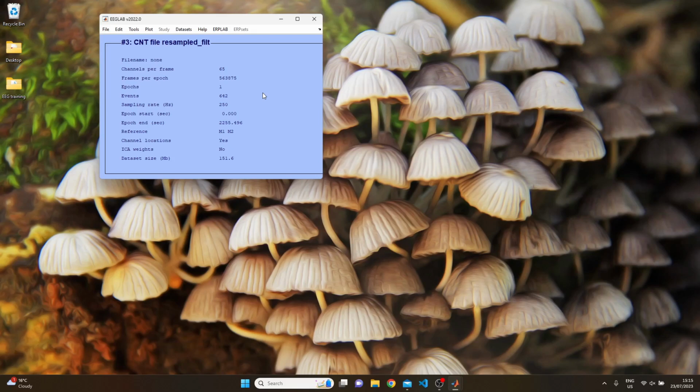The second method, and the one we'll go through in the present video, is to prepare the original dataset for ICA without creating a new set. You can choose to use whichever method you prefer. The former may mean that ICA runs quicker and produces better decomposition, particularly if you have fairly noisy data. But the approach we'll follow here will take up less space on your PC if file size is an issue. It's less time intensive and may work sufficiently well for your purposes, although running the ICA itself might take a little bit longer. So, to prepare the dataset for ICA, we're going to visually inspect and clean it.